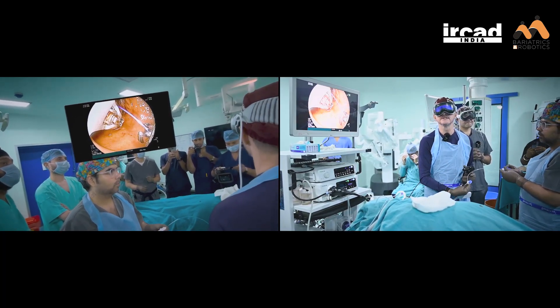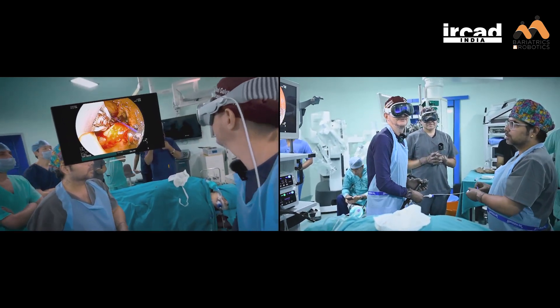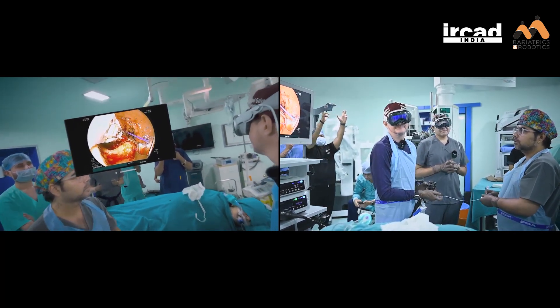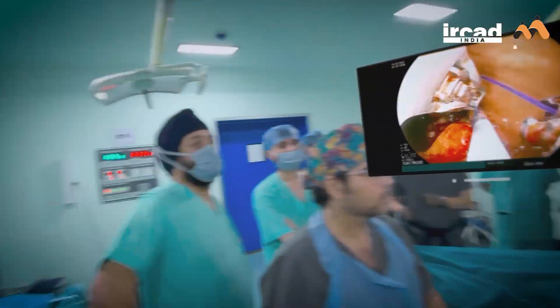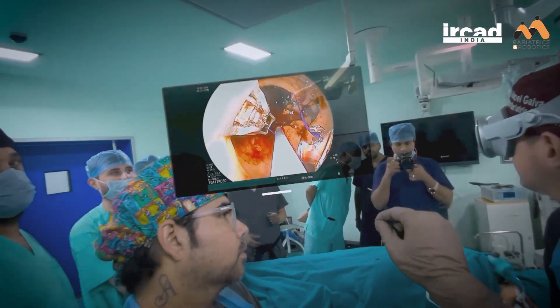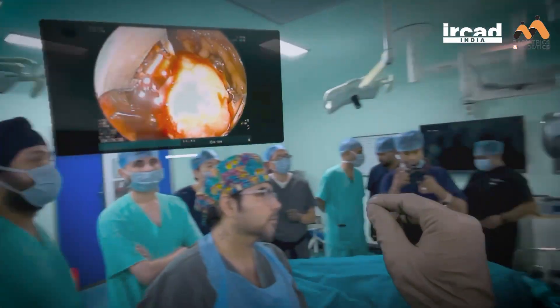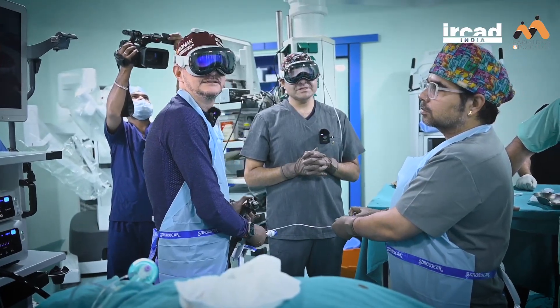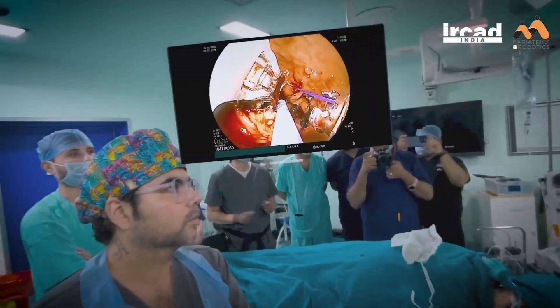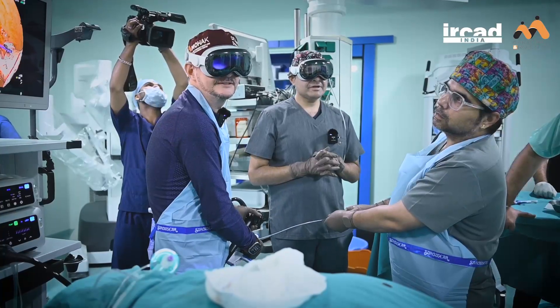We are reducing — almost finished. One of the things I wanted everybody to know: the device is not exchangeable. You need to buy your own because it will track your eyes — it has artificial intelligence. My precision in making the screen small or large, taking it anywhere, is very precise because it tracks your eyes. Once it tracks your eyes, you'll obviously need a prescription lens — you need to go to an ophthalmologist to get a recent one, otherwise Apple will not give you one. Even so, I am able to do very, very complex and precise movements.